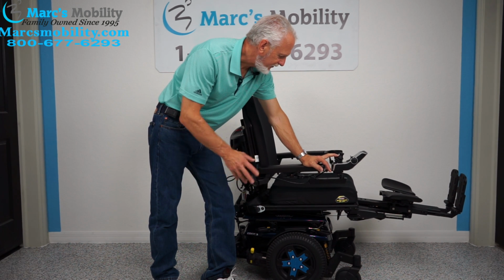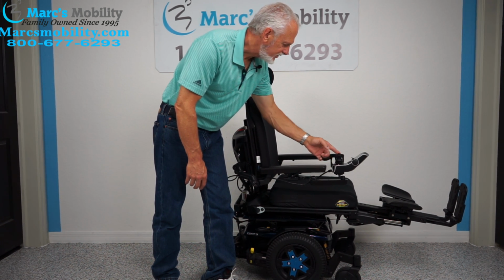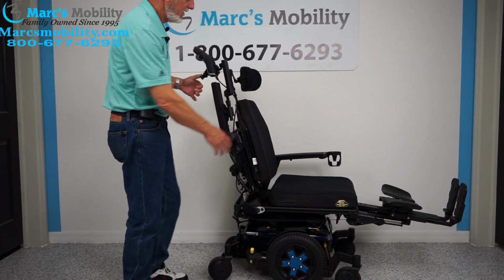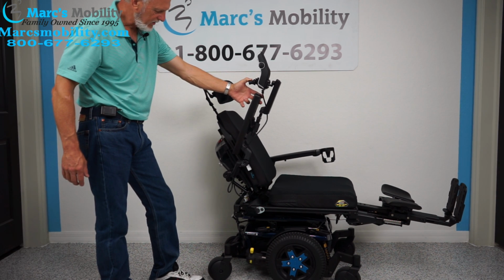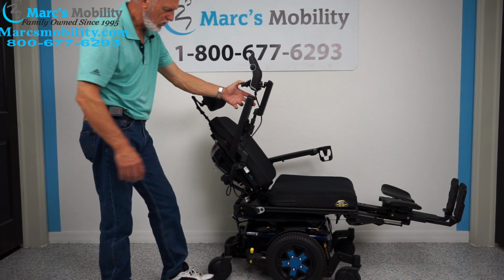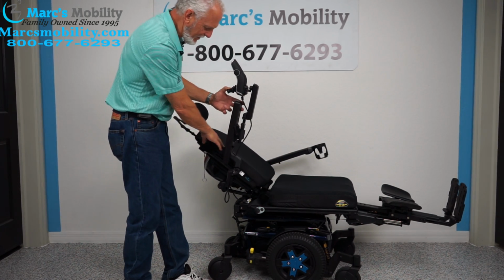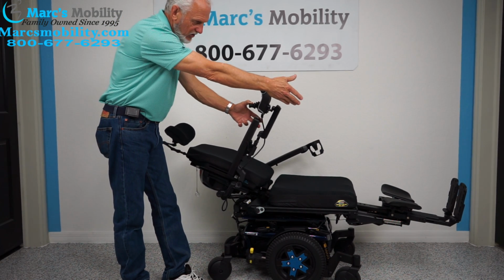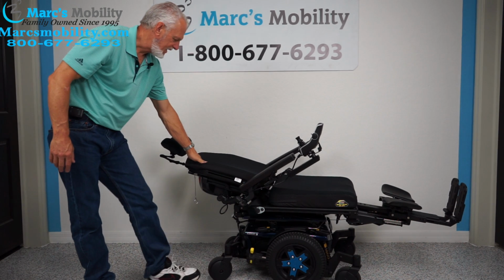Now the last function on this chair is called the electric recline. The electric recline is just the back going back by itself. You can see it going back. That's called the electric recline. Earlier we did the tilt. When the bottom and the back goes back, that's tilt. This is just the back going back. So if you're going to lay down flat, this is how far your legs would go up, and this is how far your back goes, it's all the way down right now.